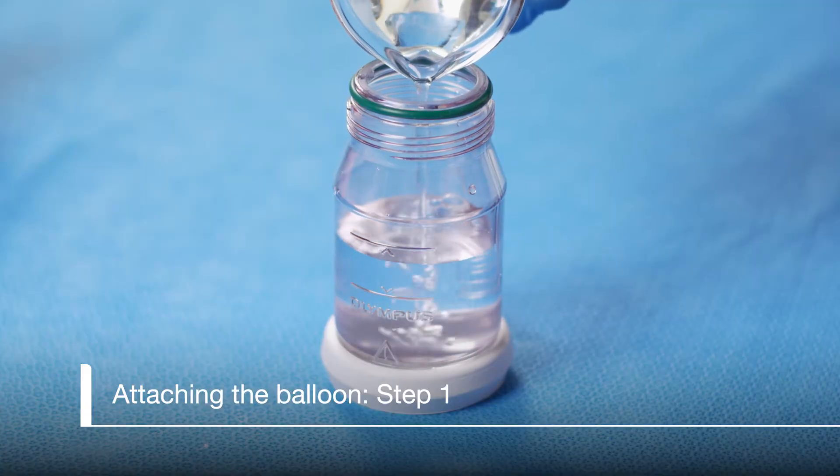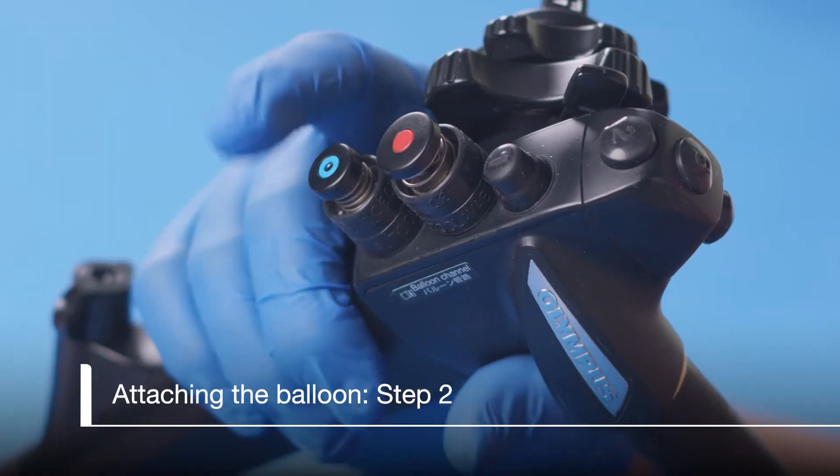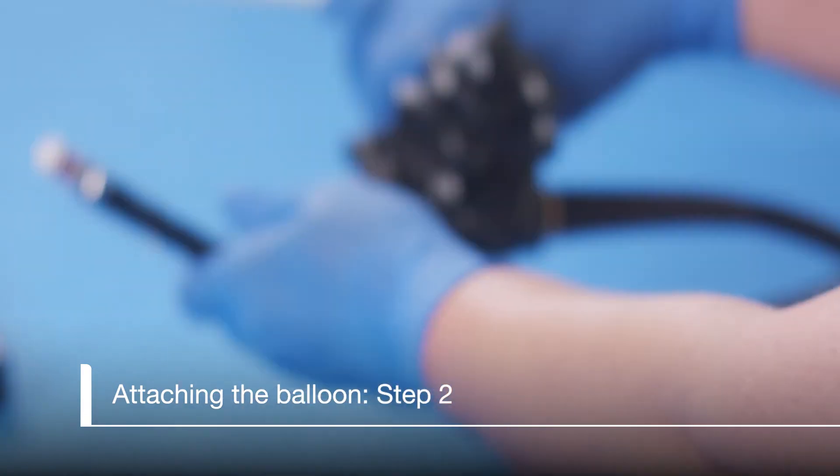First, fill the water bottle with water to the fill line only — do not overfill. Depress the air water valve completely until the water flows from the balloon water supply port to eliminate air from the channel. Do not depress the suction valve. The scope can now be set aside.